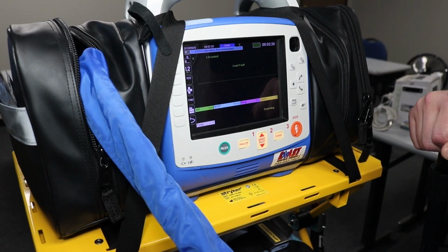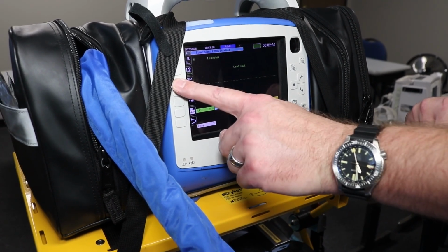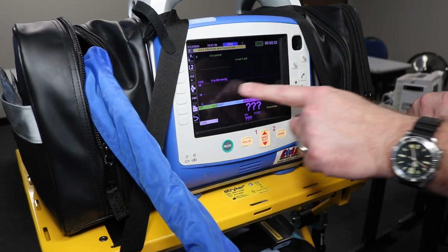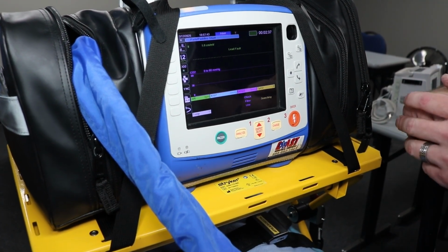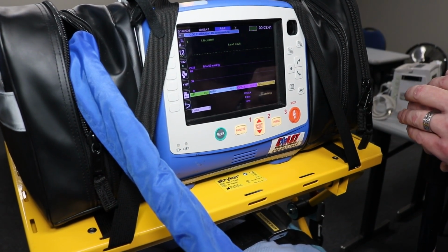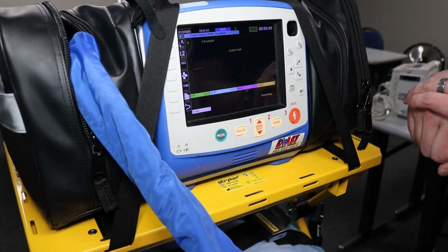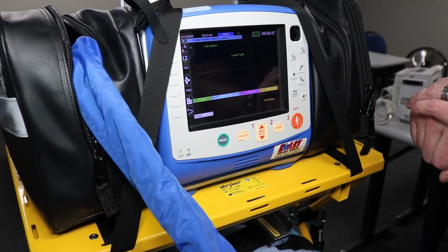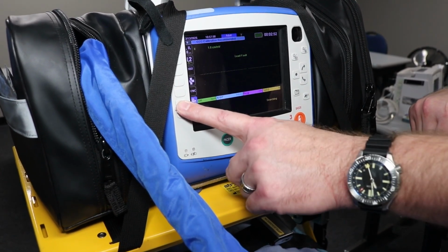If the nurse is utilizing end-tidal CO2 for a vented patient, it'd be the next button down. You would see your end-tidal CO2 register here. Once you hook it up to your vent circuit, then you would see your reading. You can turn that off now by simply pressing that button again. If I needed to print a strip, here's our print button. Hit it once, and it will print.